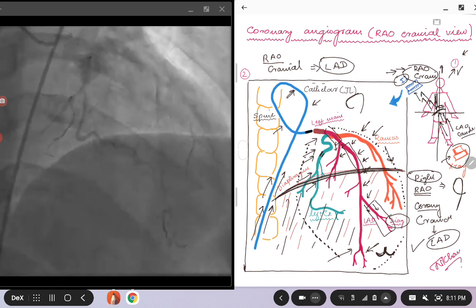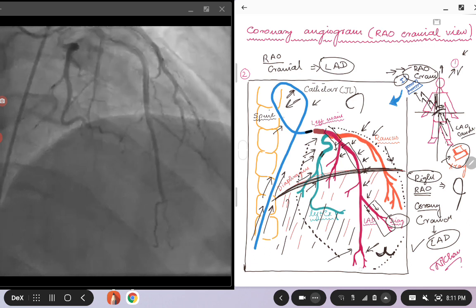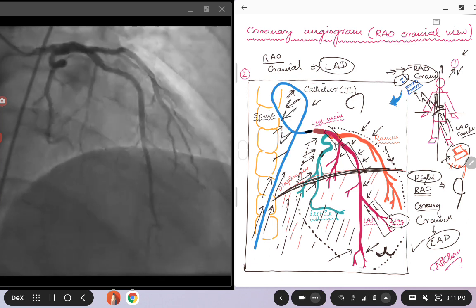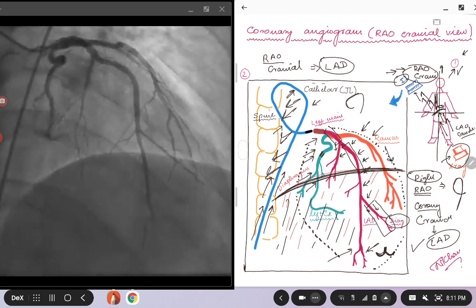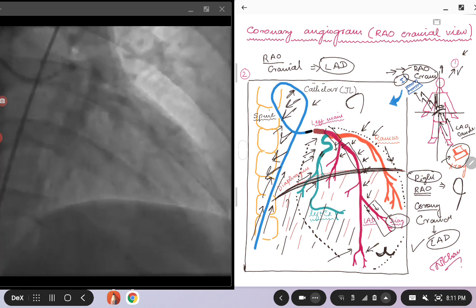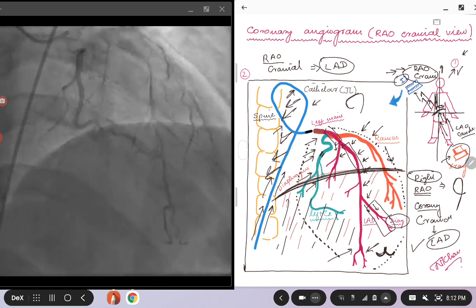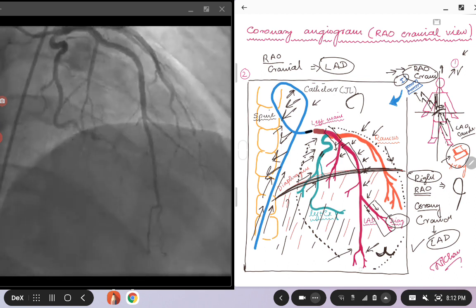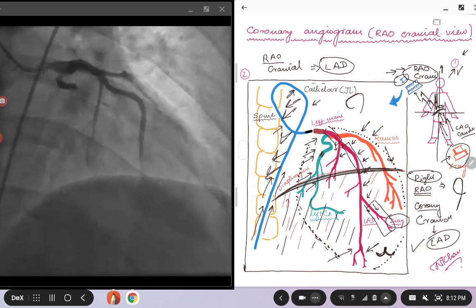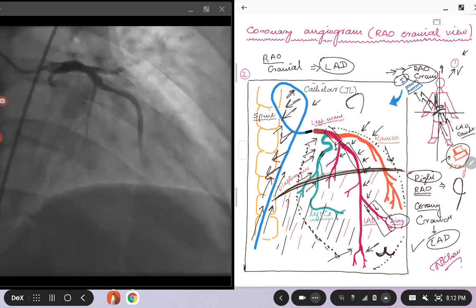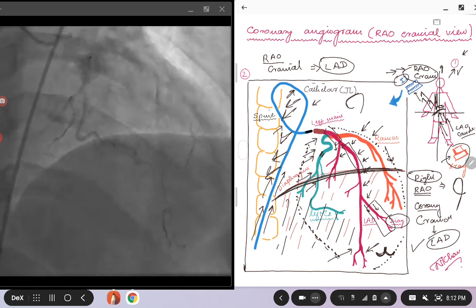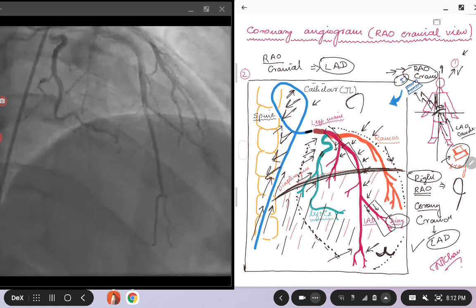This is the way you will see the image in the cine view. The spine will be on your left, on to the left of the screen. This is all because if you have the understanding that the x-ray source is on the opposite direction of the image intensifier or the way the image is labeled. The heart border will be a little rounded. Not a very good view to do an LVgram, but you can still see the heart borders. If you want to do an LVgram, probably going straight RAO would be a better option.